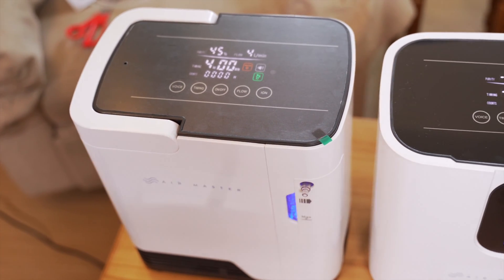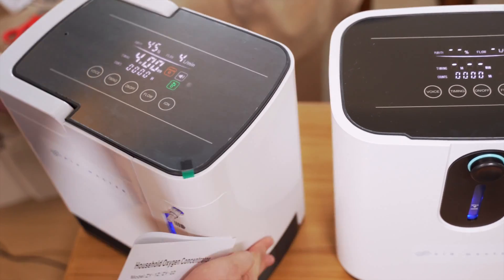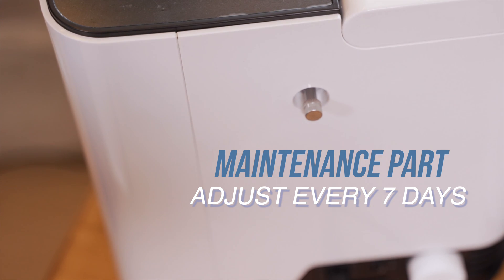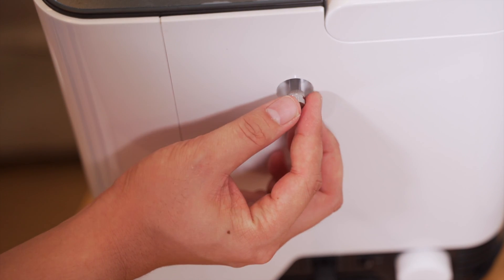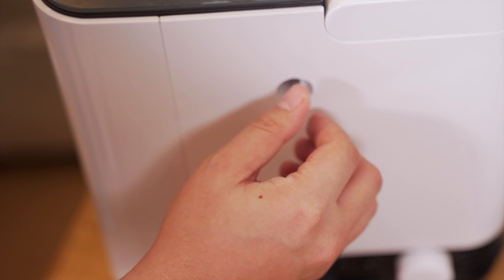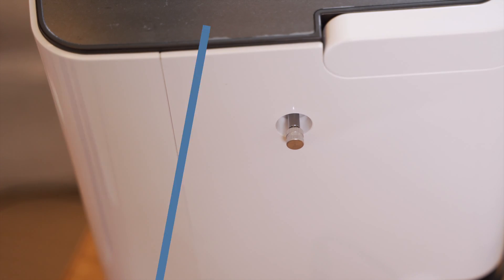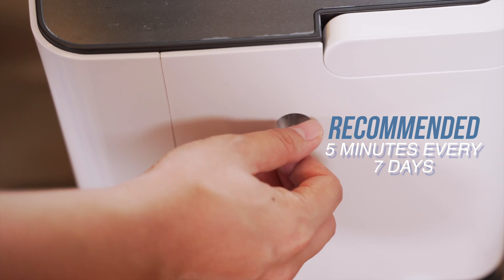Now we'll discuss the maintenance port, located at the back. This is used to remove water vapor and needs to be adjusted at least once a week if you use it every day. When you turn it right, it's tight. When you turn it to the left, it loosens and releases water vapor. It's recommended to do this for around 5 minutes to release water vapor at least once a week, and then tighten it back.